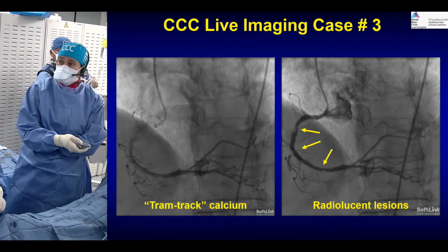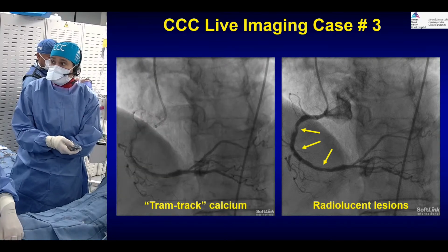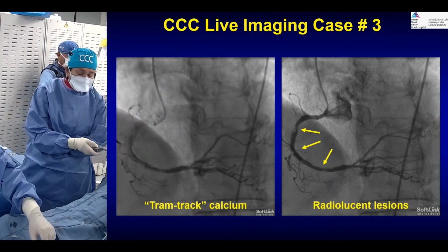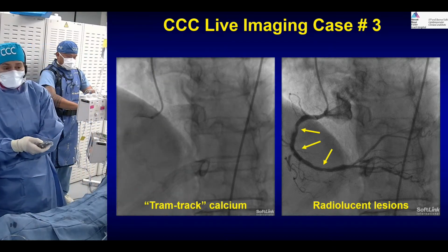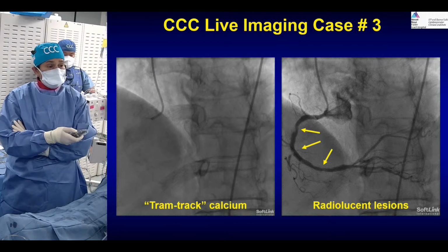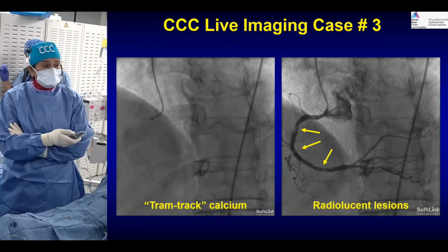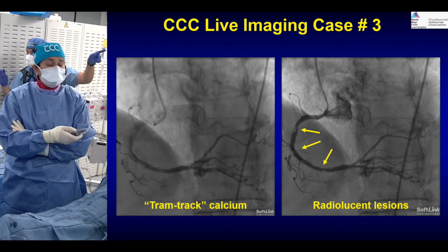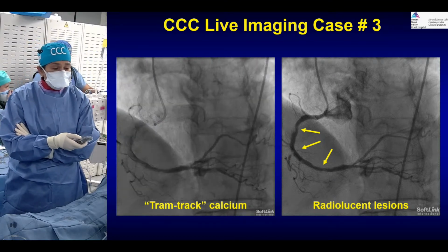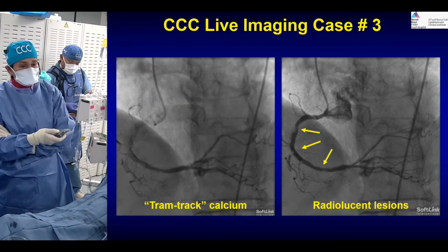So this is what we had shown, our tram track calcium. Remember now, nodule is becoming something being used regularly. Before imaging was part of our life, when you saw a calcific lesion, the only way we decided it was a nodule was, as we were doing calcium modification, the more difficulty we faced, we used to think, okay, that is because there is a nodule.